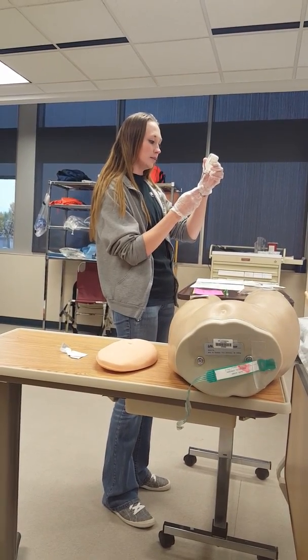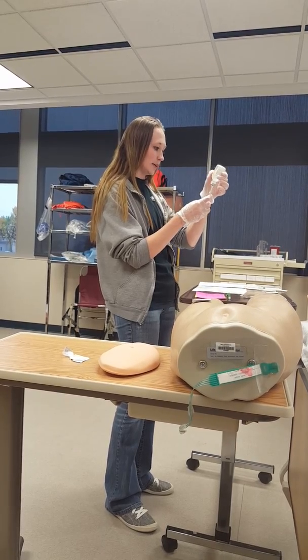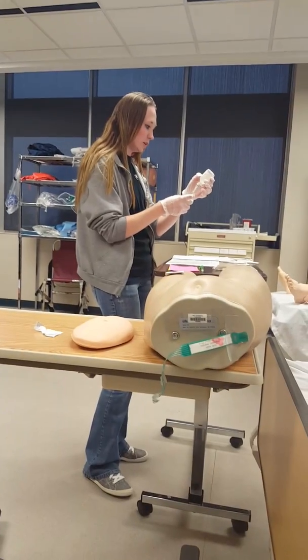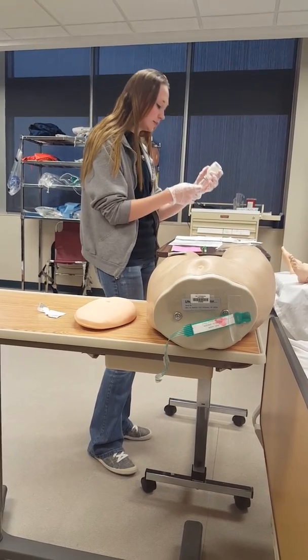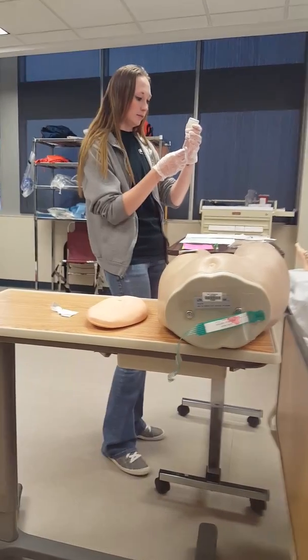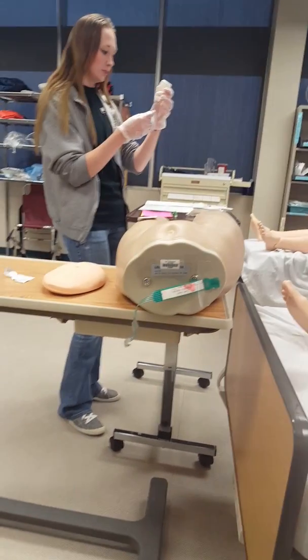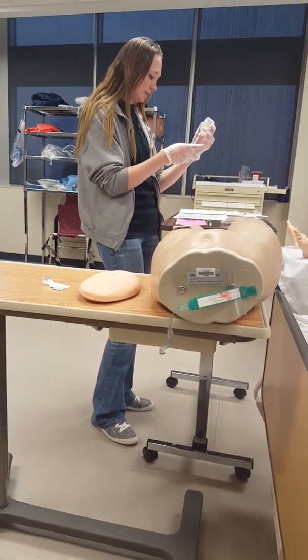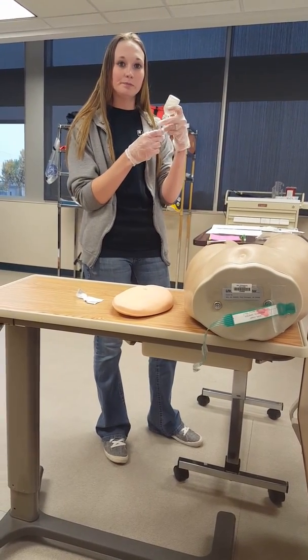I'm going to draw back the 10 units that I'm supposed to, and then I'll check it against the MAR. I'm giving Novolog 10 units, and my MAR says Novolog 10 units, and then I would do it again. Novolog, 10 units, and to the MAR.